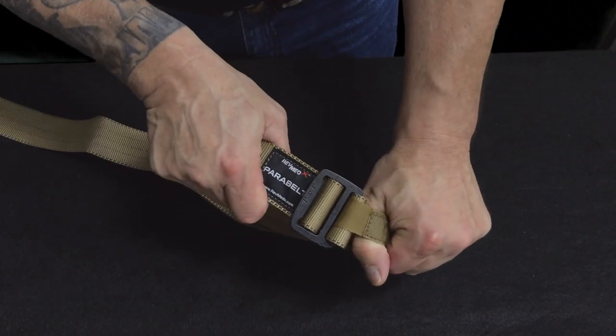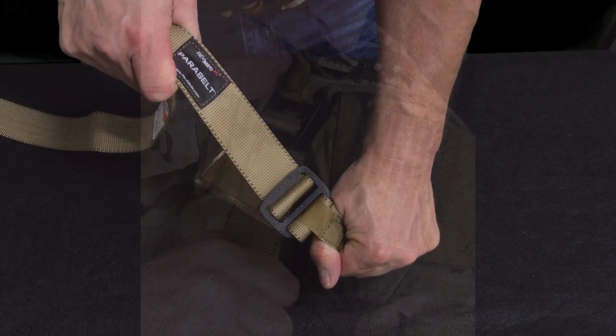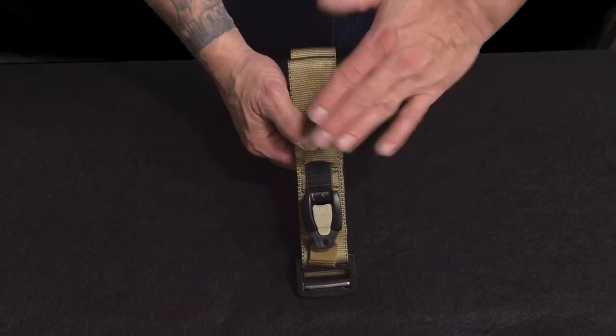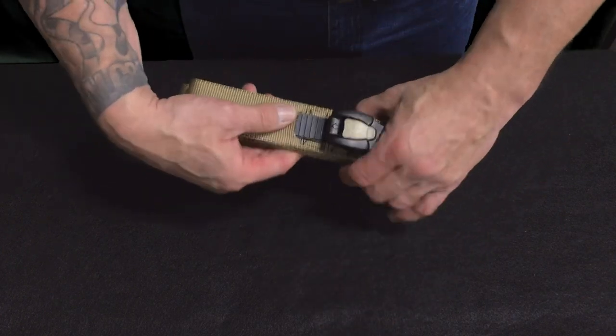The thumb loop provides a counter pull when tightening the webbing. This loop can also be used as a bite loop to assist when self-applying to your arm. The release tab sits flush with the lever arm to prevent accidental opening of the ratcheting during transport.